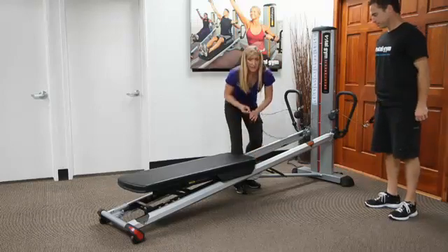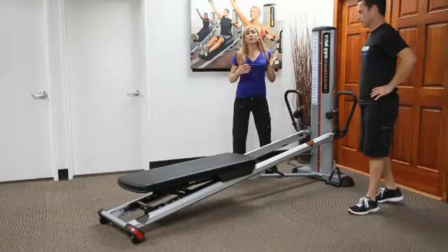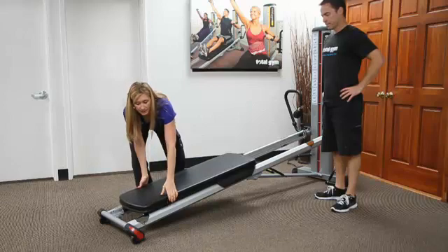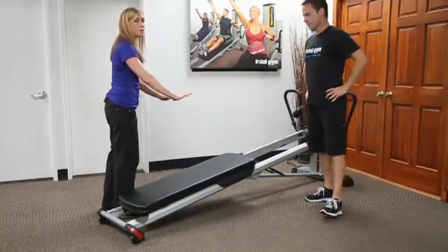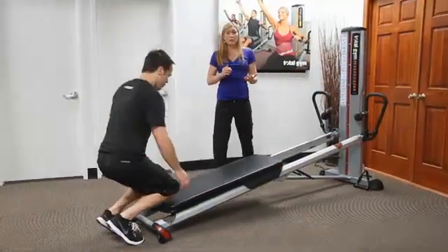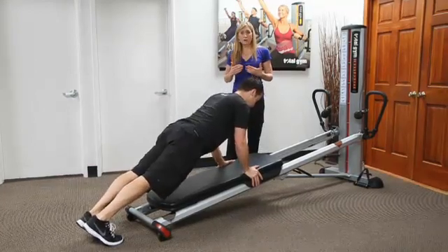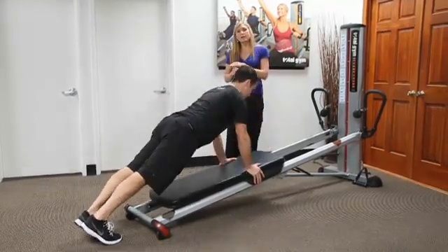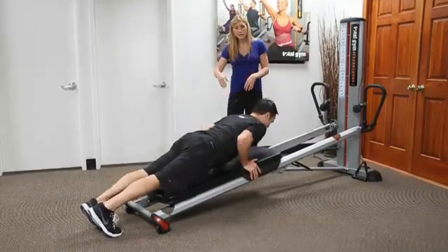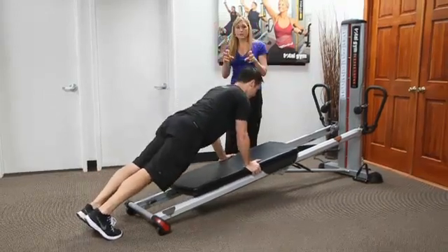One of the beautiful things is that you can take the total gym and you can take an exercise such as the plank and really kind of build upon it. So let's say I'm going to bring this down and I'm going to have him move to where he's going to be in a push-up position. And if he's doing a push-up and I think this is easy, or it's a good strength requirement for him, but I want to make the exercise a little bit more challenging for stabilization, I can have him walk his hands down the board, push the board up, and now we turn this an open position.